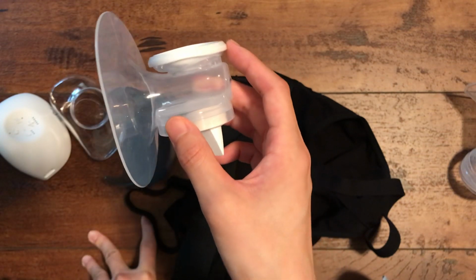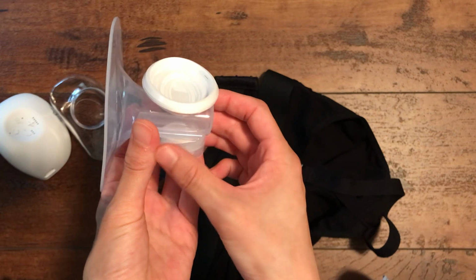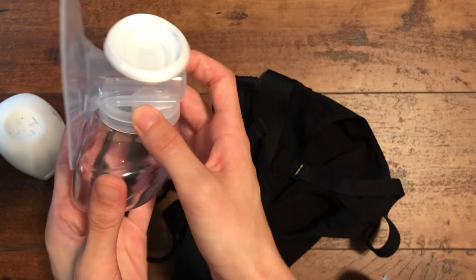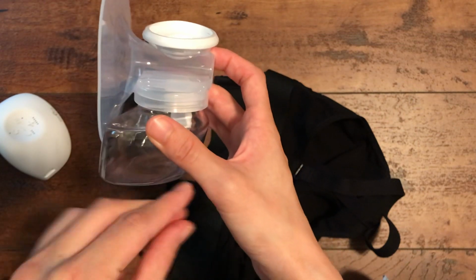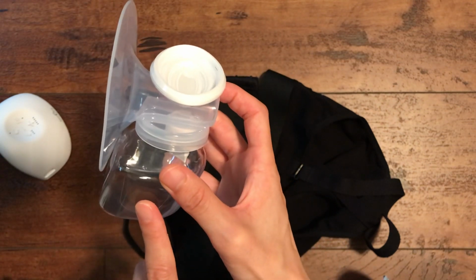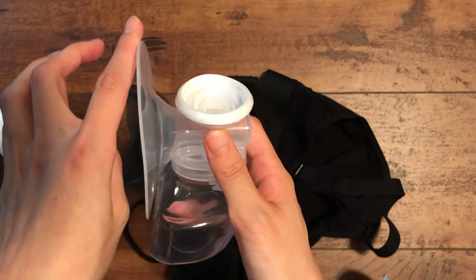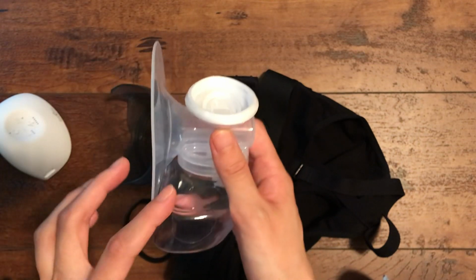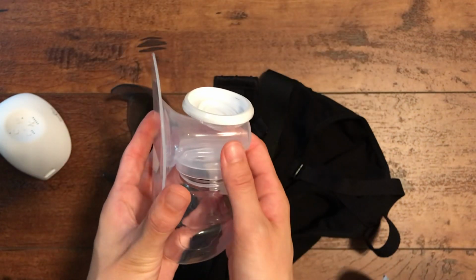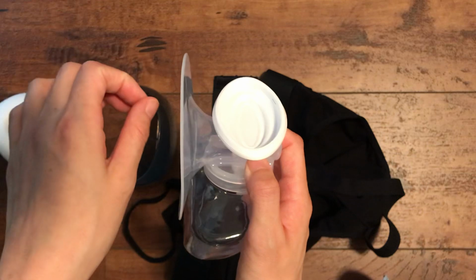So you want to make it similar to this, where it tips over the other way, and that's why, at the bottom where the bottle is, I tighten the area where the bra touches, so that it tips slightly over this way. If you have a small chest, or if your chest isn't fully covered by this phalange opening, this phalange opening is very big, by the way, so it may not cover your entire breast. But it's okay if you see a little gap here between your breasts.